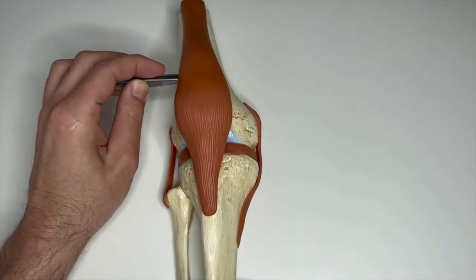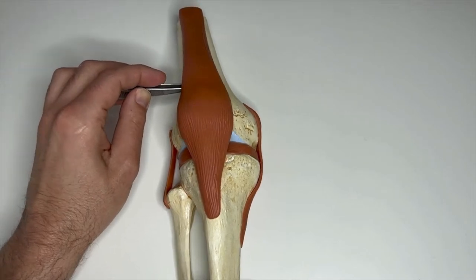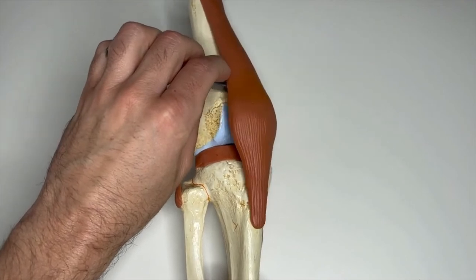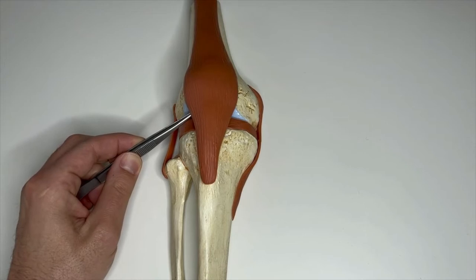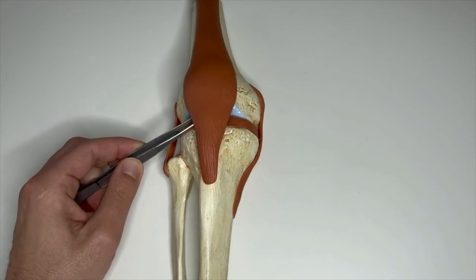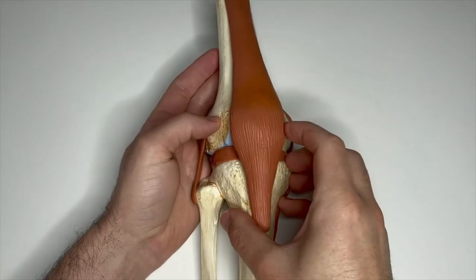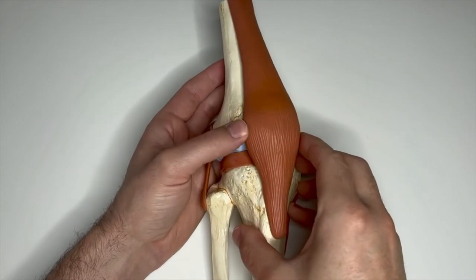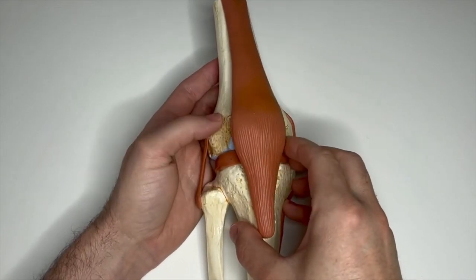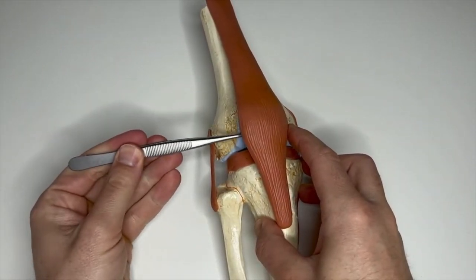If a very narrow joint space is present, an additional suprapatellar portal can be created. You can elevate the patella with the retractor. If only a few millimeters are missing to reach the defect perfectly, it is advisable to use the arthroscope like a lever to lift the patella a little out of the trochlea, as you can see here — in most cases this is sufficient. If you want to treat the medial or lateral patella facet, you can also shift the patella toward the defect, increasing the distance between the patella side and the trochlea so you can easily reach the defect with your instruments.